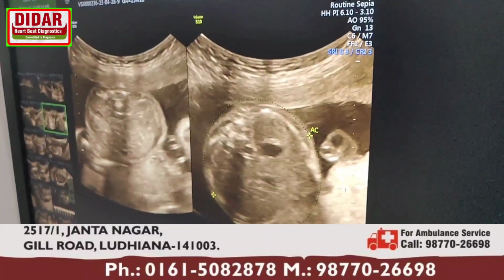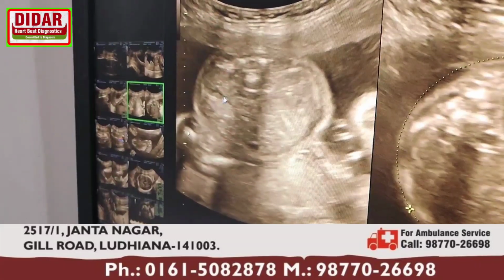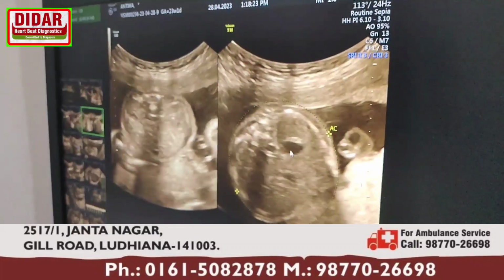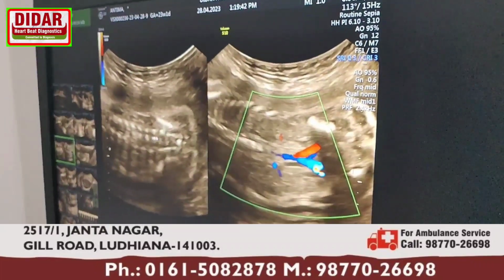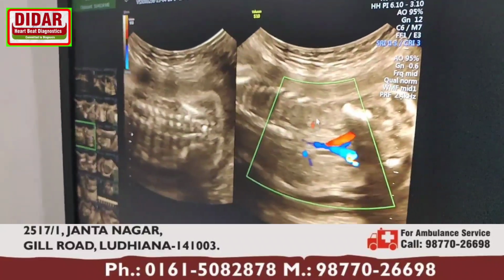In the next slide, I am able to see the kidneys. This is the backbone, this is the kidney, right kidney, left kidney. Then I have taken the abdominal circumference, this is the stomach. Then we see the spine in coronal section. This is the tip of the bone, two iliac bones. Then the two renal arteries.